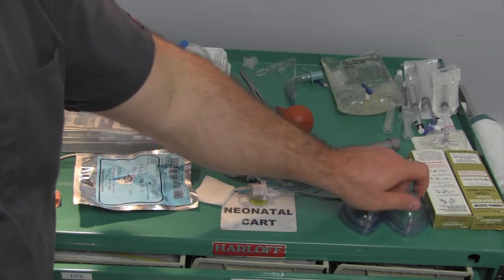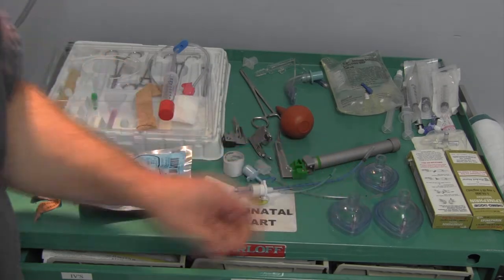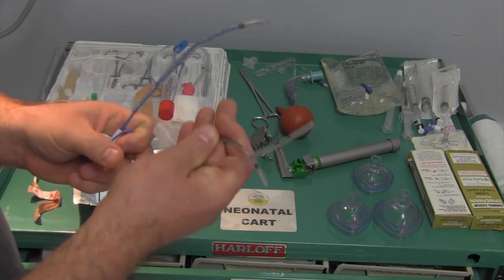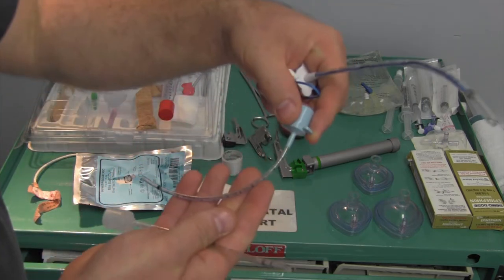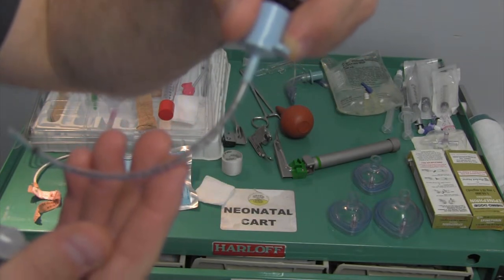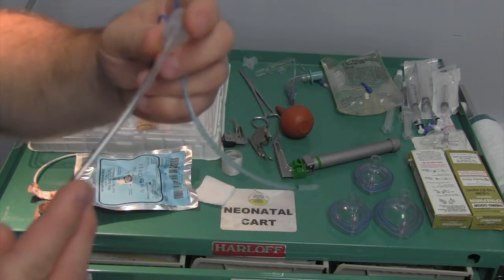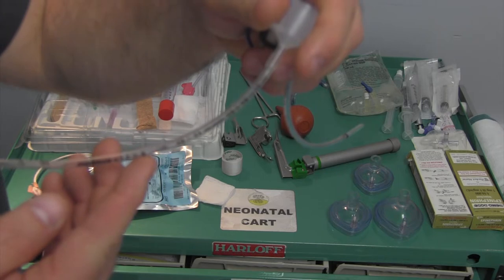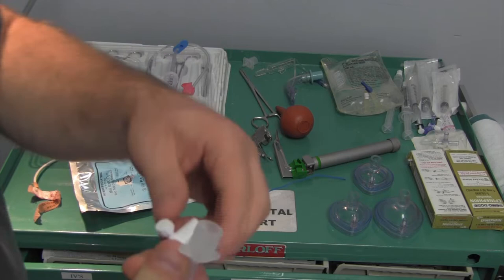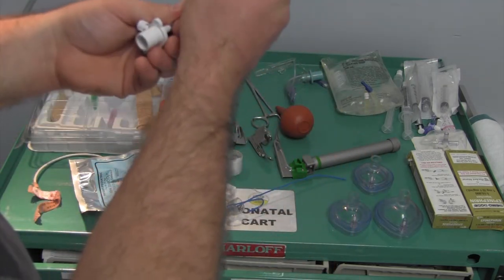We have two different sizes of Ambu masks that will adapt to our T-piece resuscitator. We have three sizes of endotracheal tubes: 2.5, 3.0 - which refers to the inner diameter - and 3.5, inside which I had a stylet. You can see a marked difference in the length of these endotracheal tubes.